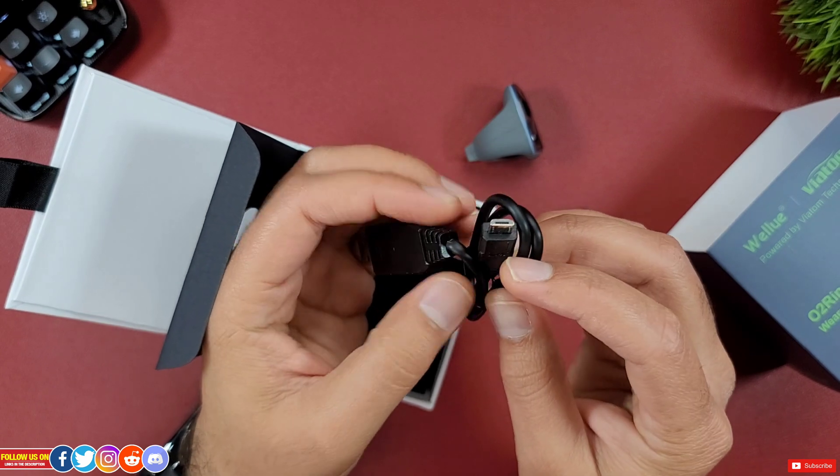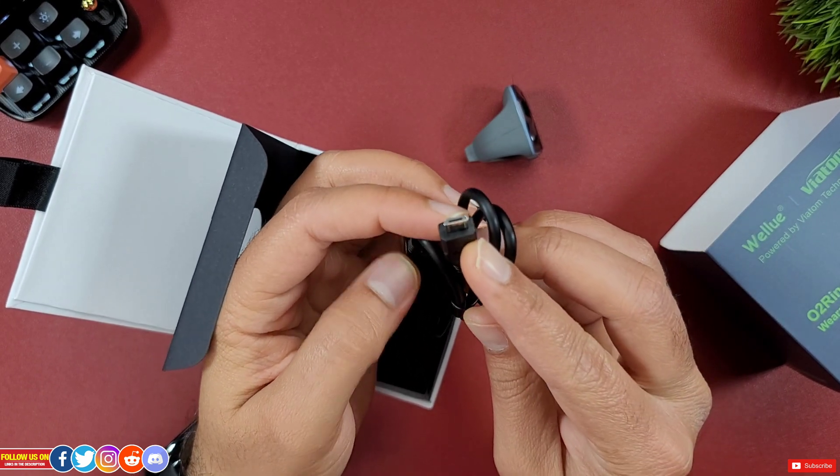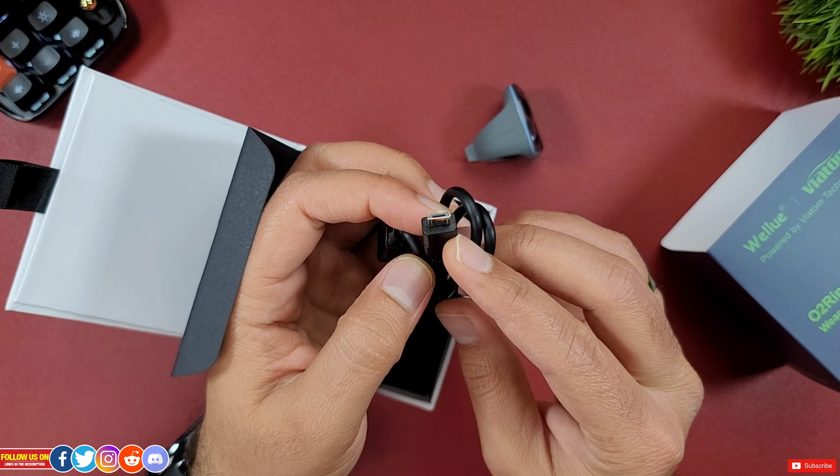During this video I'll show you how to transfer readings from this O2 ring to a smartphone via Bluetooth or to a PC via this cable.